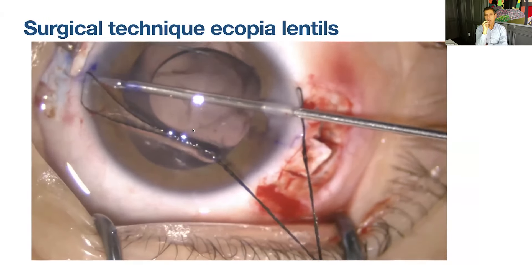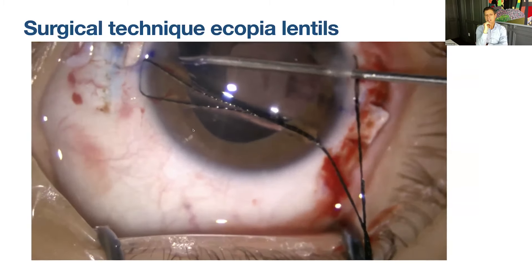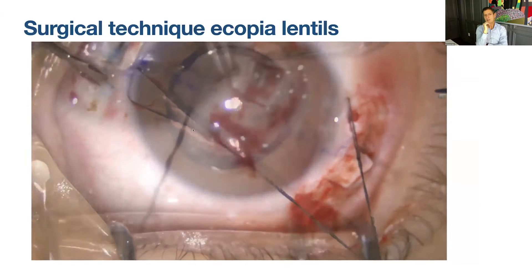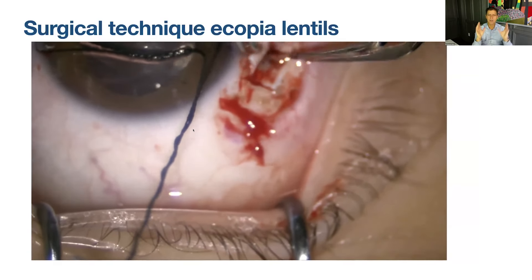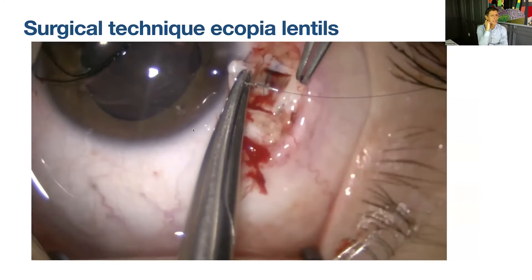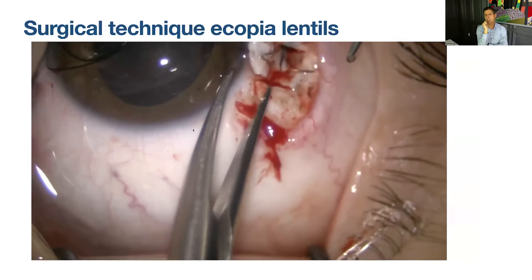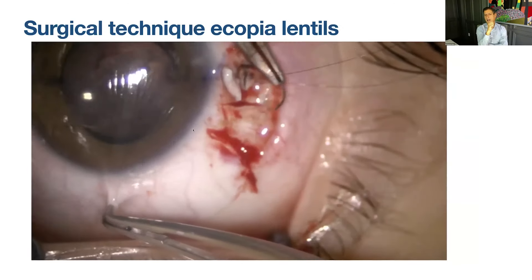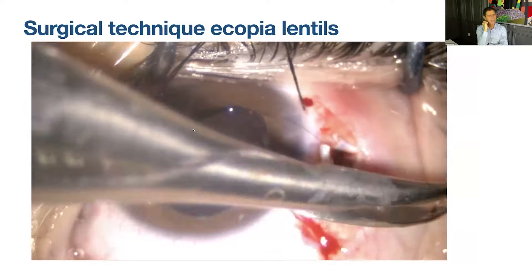These are very young patients — we want our technique to be very slick and refined, interfering with the vitreous as little as possible. Once you exteriorize the haptics, tuck them into the tunnels and center the lens. I like to place a suture closing the sclerotomy — an X suture, double-pass suture — which closes the sclerotomy and holds the haptic in place. Then close the scleral flaps and close the conjunctiva with 7-0 Vicryl. With this technique, if you take all the measurements correctly, the lens is very well centered with seldom tilt.